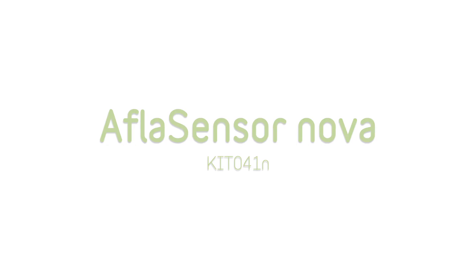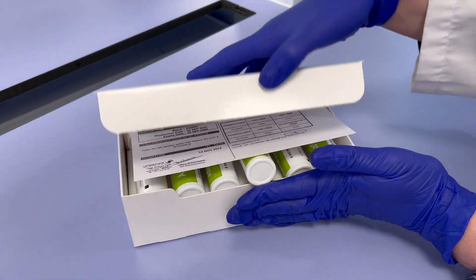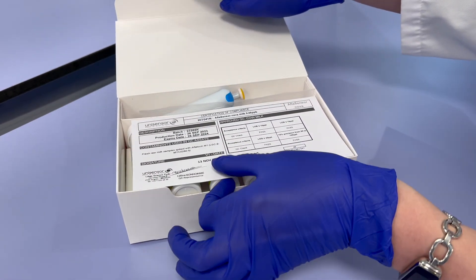AFLASensor Nova testing procedure for milk. The kit should be stored between 2 and 8 degrees Celsius. Allow the reagents to reach room temperature in advance.